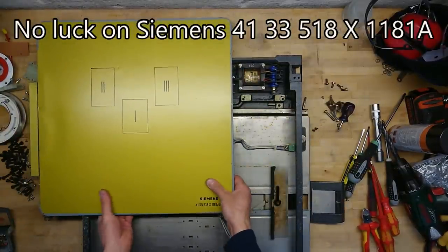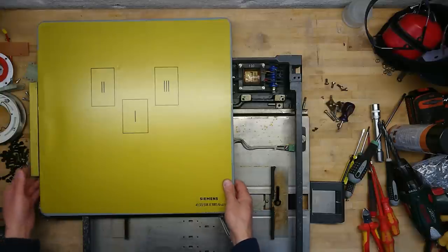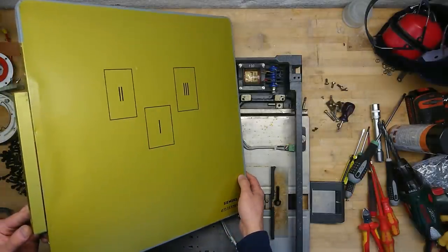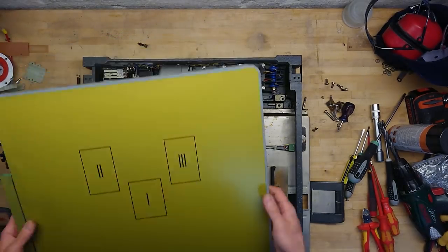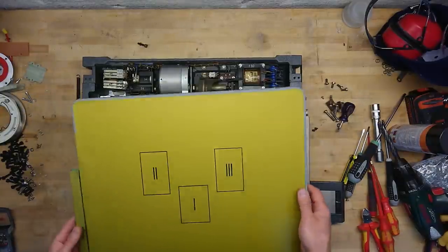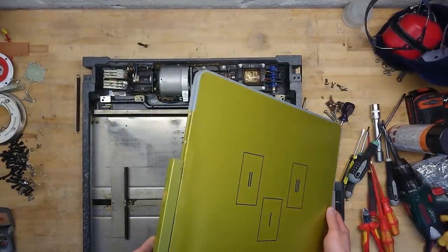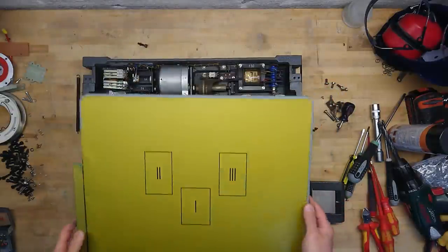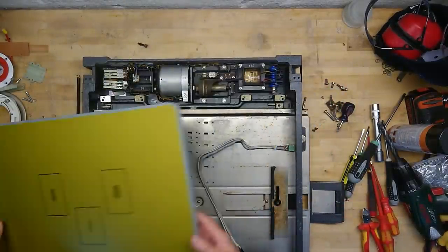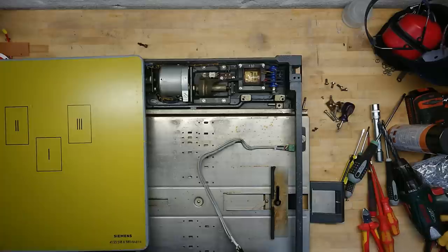Because this clearly has a feel to it like it's a grid plate. So I'm wondering what this can be used for, because as it's shielded up, that has to do with light. But it's a little too lightweight to actually contain elements that would light up on radiation. So it's certainly not crystals, and I think it's too old to be plastic based. So I'm not quite sure what that is.